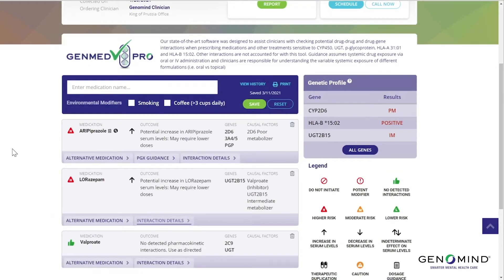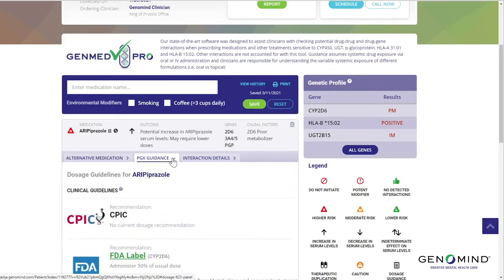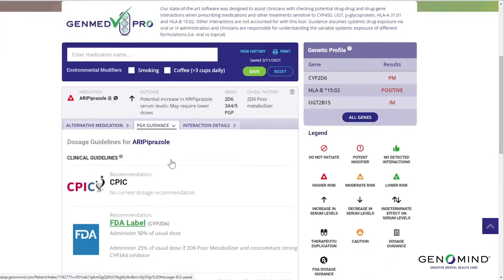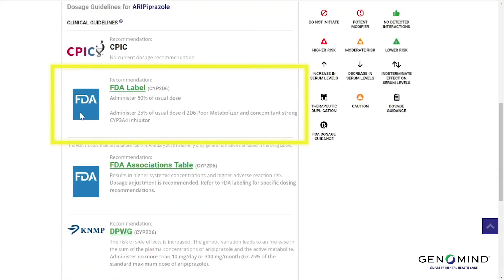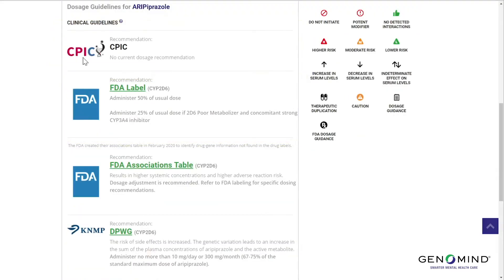Let's go back to aripiprazole for a second. GenMedPro has alerted us to a potential higher risk interaction, but it would be nice to have some more specific guidance on what to do about that interaction. Let me introduce you to the PGX guidance tab. Clicking this will provide you with detailed guidance from one of three sources: the FDA, CPIC, or DPWG. The FDA maintains a table of pharmacogenetic biomarkers and associations, and we have curated them for you right here in GenMedPro.